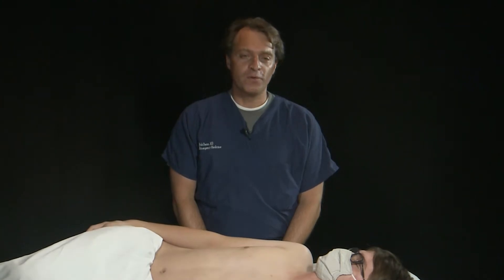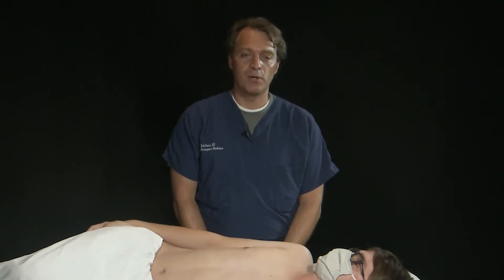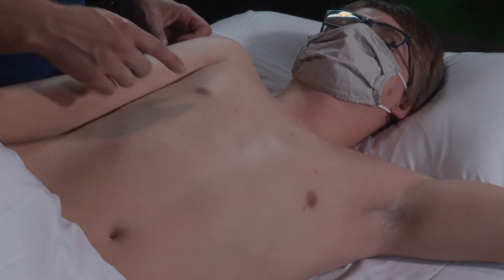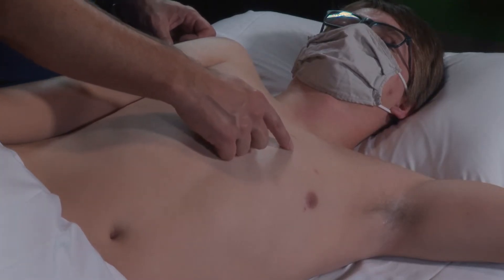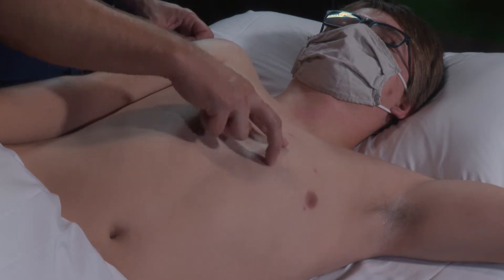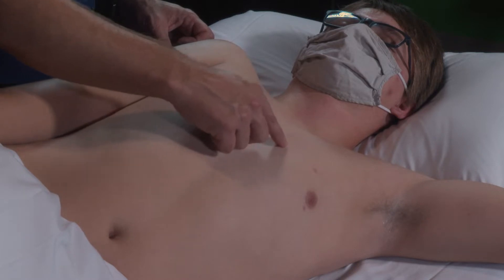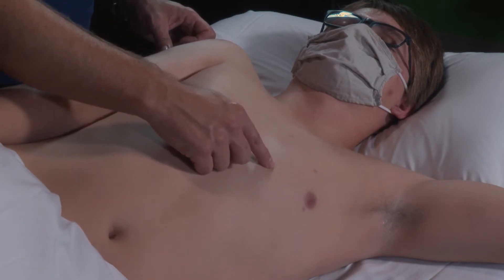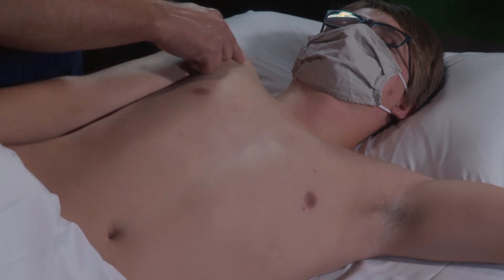For our traditional four-view cardiac exam, we're going to start in the parasternal long axis view. To find our parasternal window, we're going to place the transducer immediately lateral towards the sternum, somewhere between the second and the fifth intercostal space. For the parasternal long axis view specifically, the marker dot is going to be pointed towards the patient's right shoulder.